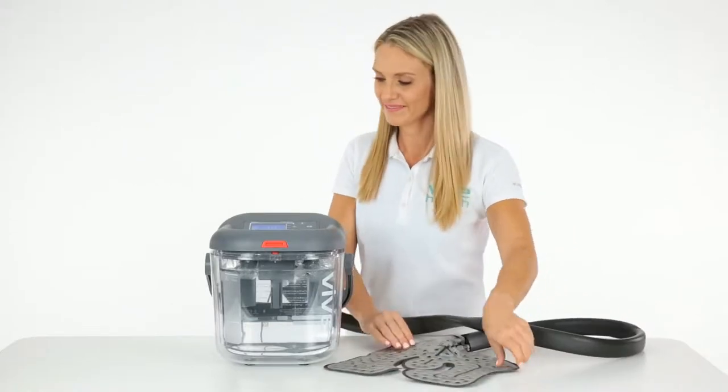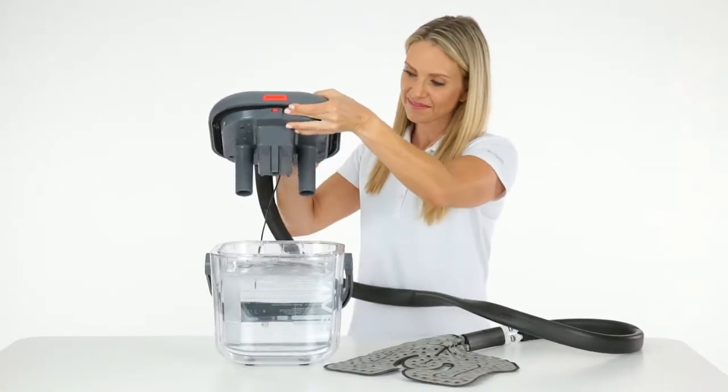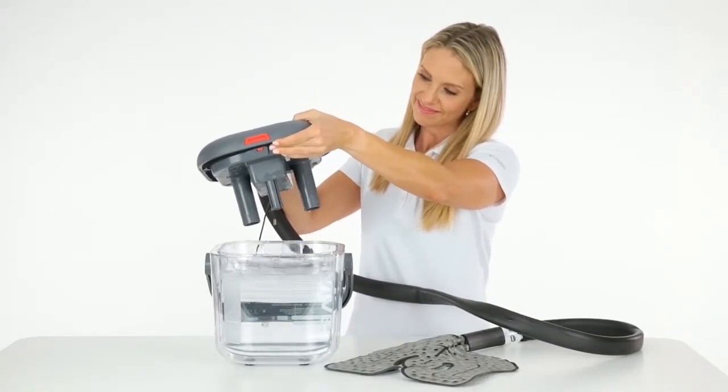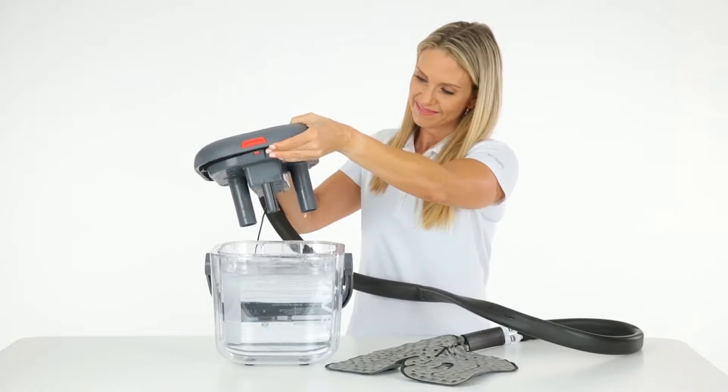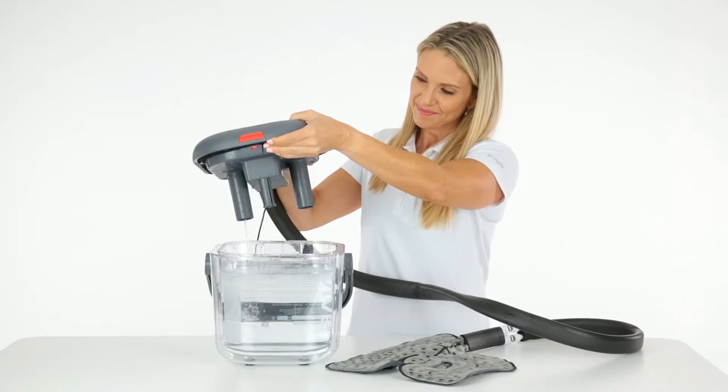To drain the cold therapy pad, remove the lid from the bucket so that it is completely out of the water or ice. Turn on the machine and hold the lid over the bucket or a sink so that you can catch the water that drains out of the pad and tubes. If needed, you can raise or twist the pad to remove any excess water.